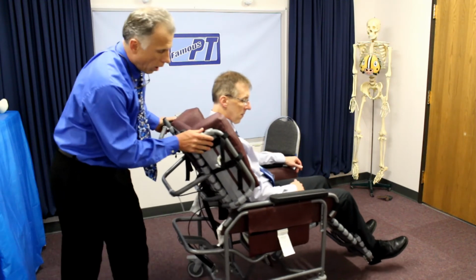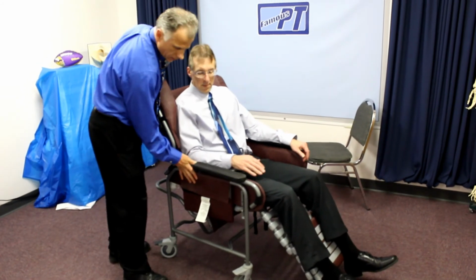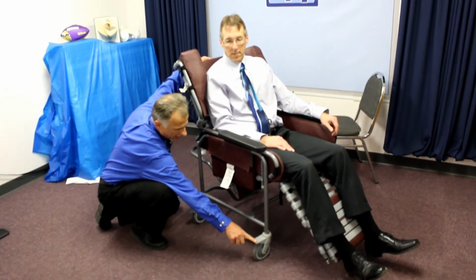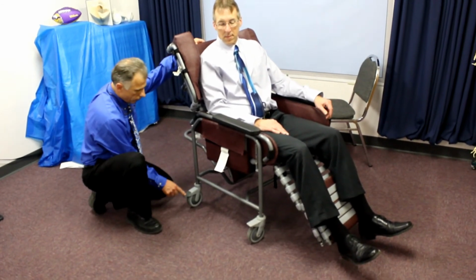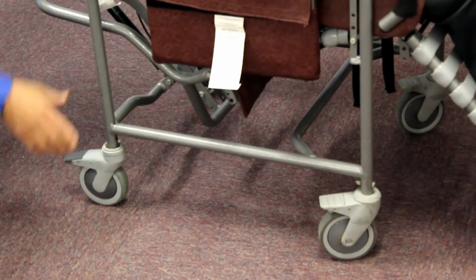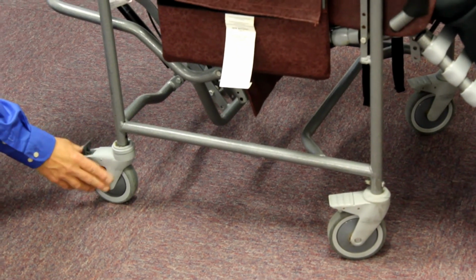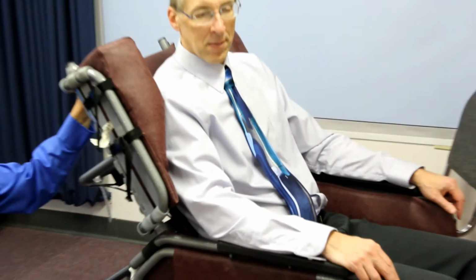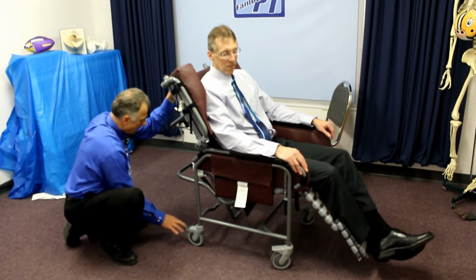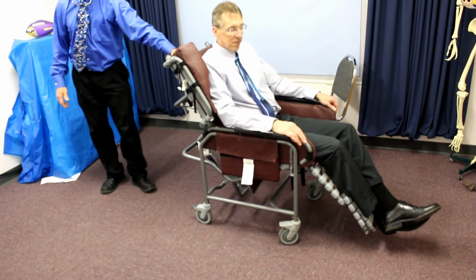Now the wheels, they're all cast on this one, and they all have locks. So when you want to get the person in and out, you can lock the wheels. Now this one, if you notice, can you get down here, Nancy? There's 3 locks that look like this, and one is a different color. And there's only one in the back, and that is for when you want to push the person down a straight aisle. You push this in, and that'll lock it from castering back and forth, and it makes it much easier to push straight down. So it won't be like a shopping cart that wants to go in all 4. Yeah, exactly. A real nice option. I don't have enough room in here to demonstrate it, but that odd color one is always in the back. Okay, cool. Yeah, it's really a nice option.